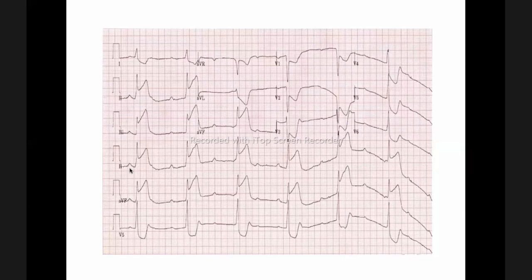Then you look for a relationship. Are the P waves in good relationship? Normal interval here. It's different here. There's even a dropped beat. Different from here. So there's atrioventricular dissociation. It's at the AV junction where the AV node is. Dissociation equals a complete heart block. So the complete diagnosis here is an inferior ST elevation myocardial infarction with complete heart block. So we have to treat for both. Right. Thank you. You're welcome.